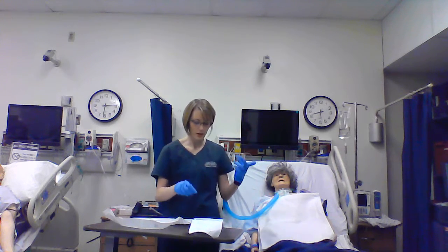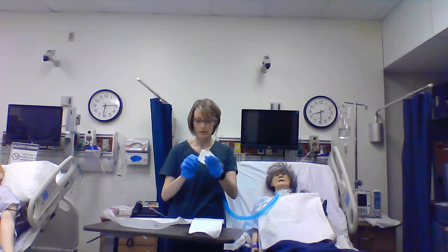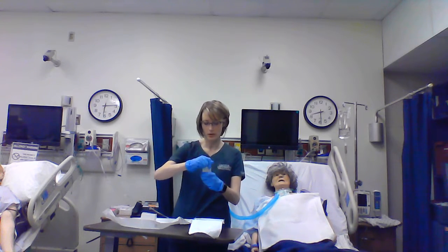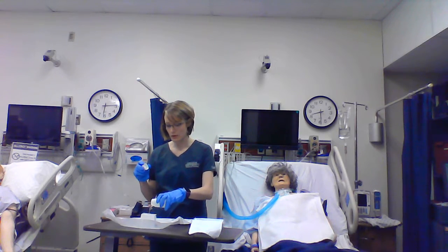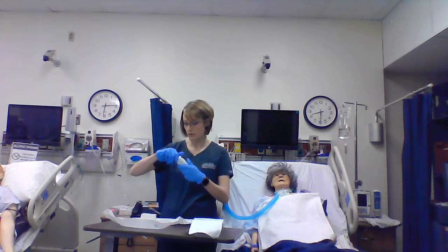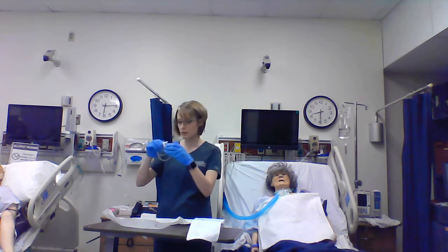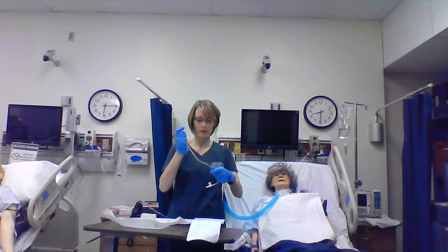And my suction is already on. I'm going to take this box out for my saline. These kits come with sterile normal saline. I would pour that into this box for clearing my suction and for lubricating the suction catheter. And then I would pull my suction catheter out. I like to wrap this around my hand just so I have a little better control over it.